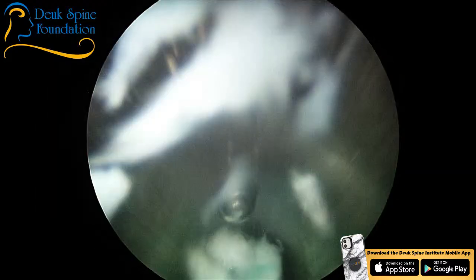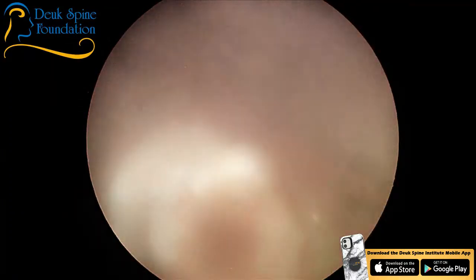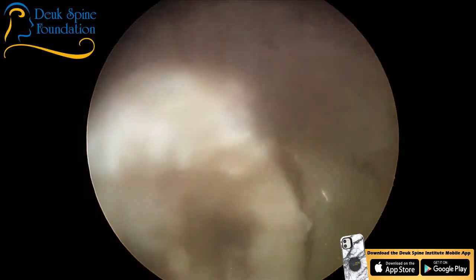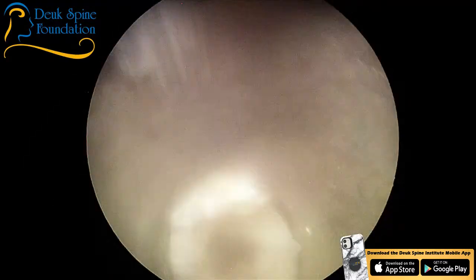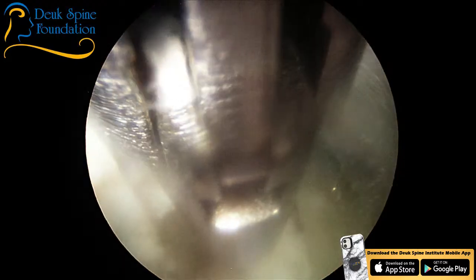Now you see that little trick, how I put the grabber in there, it stops the bleeding? That's because I'm giving some back pressure. There's some herniated disc, by the way, I'm taking out. The back pressure works because the bleeding is coming from a vein, not an artery. And whenever you have bleeding from a vein, it bleeds at about 10 millimeters of mercury pressure. And so by putting in this grabber, I basically obstruct the outflow of the liquid from the tube, and therefore I create a back pressure situation by blocking the outflow.